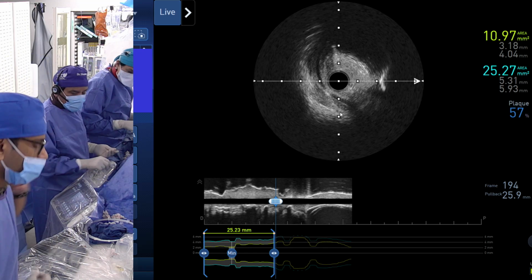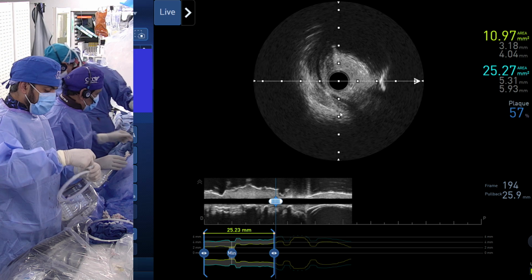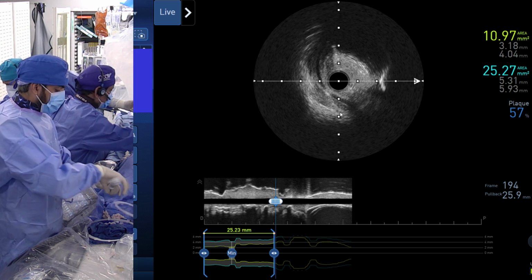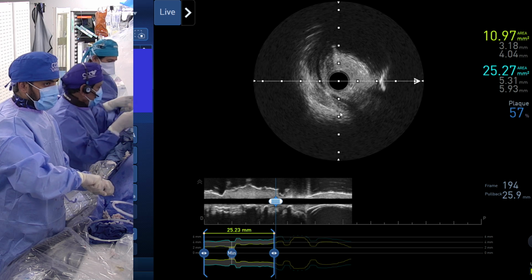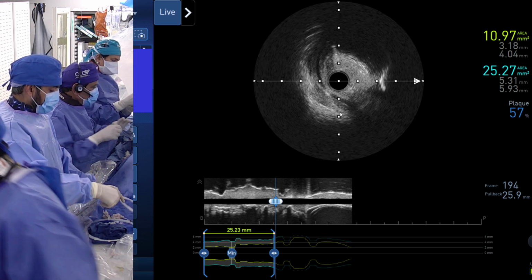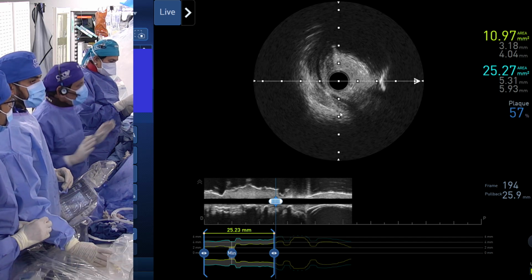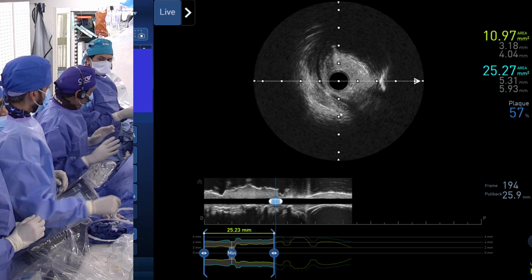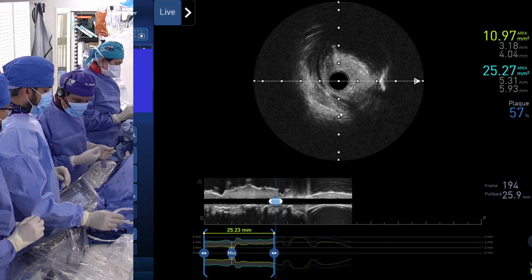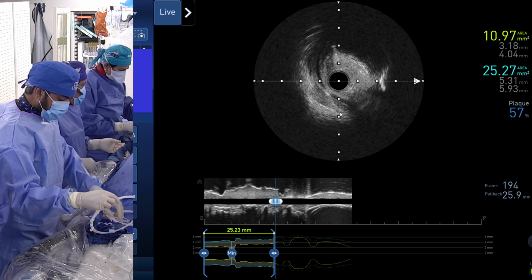Okay, so what we'll do is first we are going to do a cutting balloon and then we do the IVL. No, put the wire in the circ now. And you are right, Himanshu, if we can have no touch in this case, the circumflex will be happy. I'm the usual guy who tries to modify the side branch and go through that and kissing. But in this case, minimal will be fine.